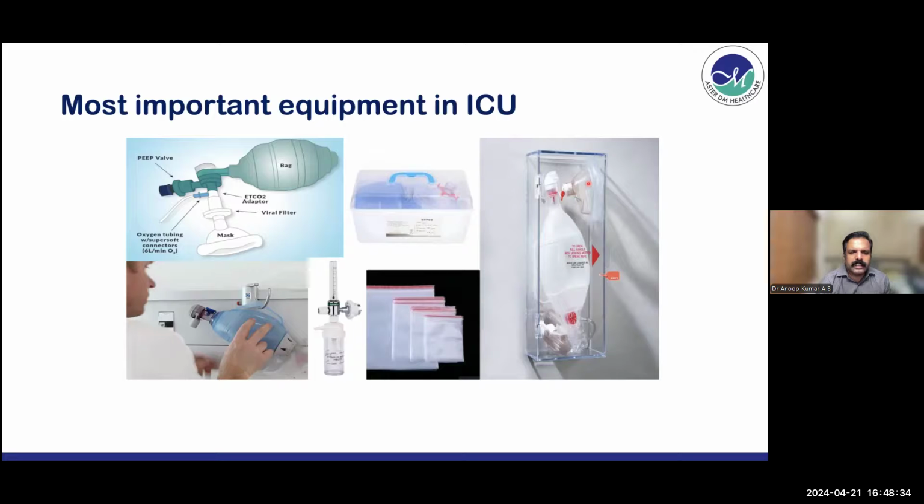But one changing concept is, previously during our post-graduation days, maybe 10 to 15 years back, even in patients who are severely hypoxic, we were trying to ventilate the patient using bag and mask by keeping a reservoir, PEEP valve, etc. I still remember the H1N1 outbreak in 2008, 9. But from that point, we have moved on to pre-oxygenation using non-invasive ventilation, where you put a mask, connect it to the ventilator and pre-oxygenate. That can give you better oxygenation, and even chest movement assessment, everything is possible.